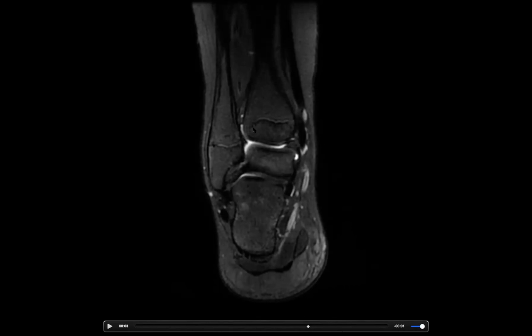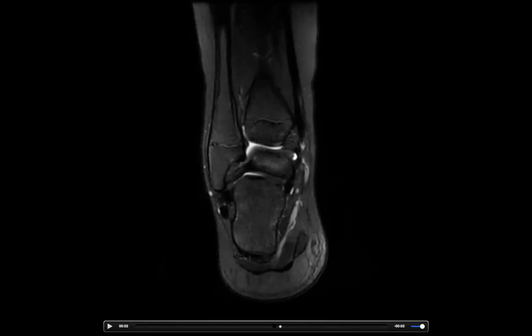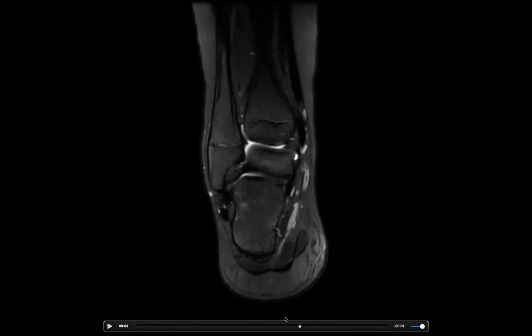Yeah, the thing I love about it is that it removes the blurring from the T2 decay. So the images have such sharp delineation of anatomy, and especially things that have short T2. So, you know, you just really see them clearly. So for example, like here, you can see these are tendons that are coming down, these really dark areas here, or these are tendons here as well. This is a ligament here. They're very short T2, but they're still seen pretty sharply here.